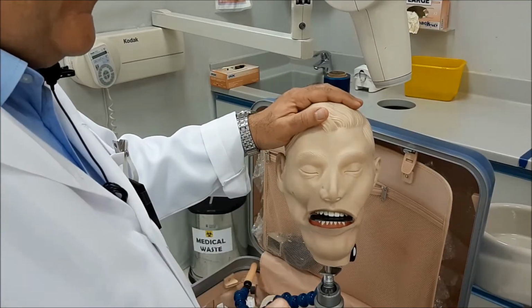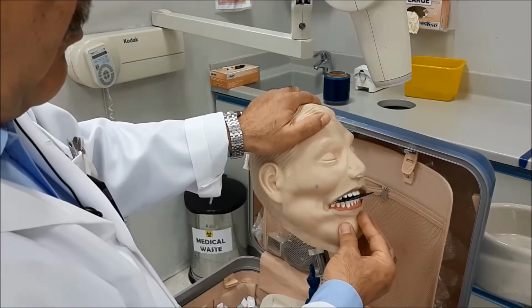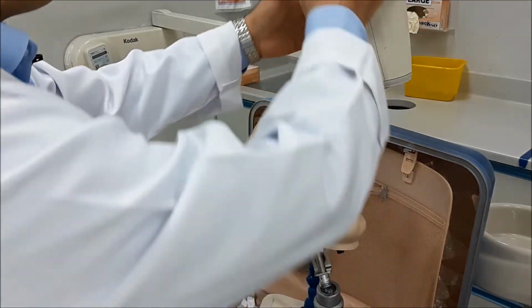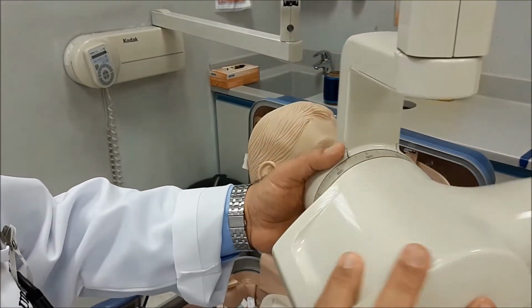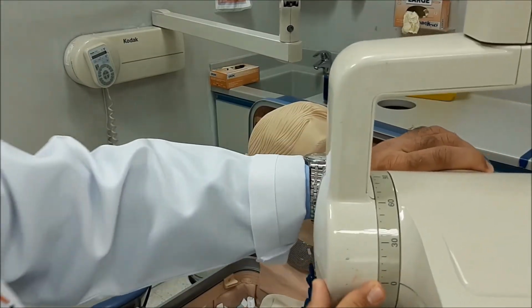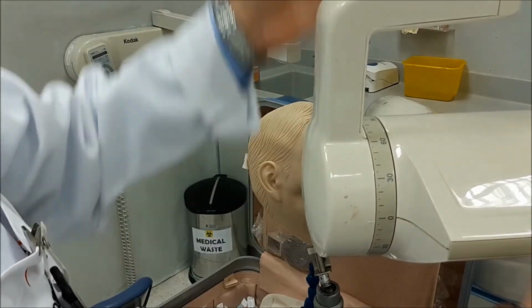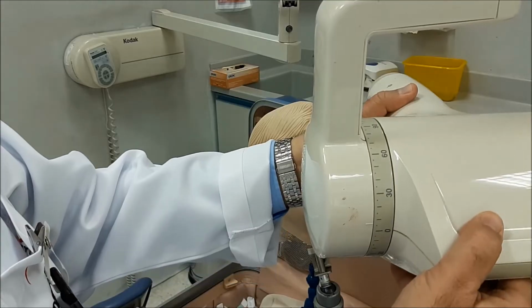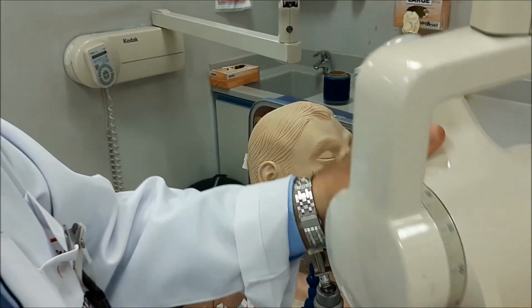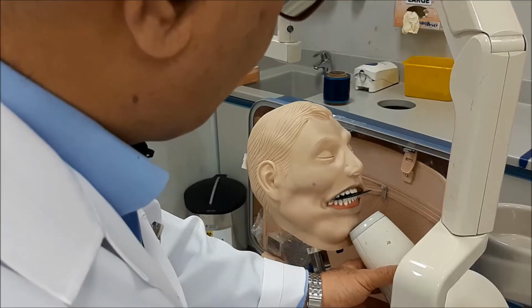Now, as in the maxillary, we have two exposures. Here, if you want the anterior part of the mandible, the symphysis and the parasymphysial areas, then you are going to direct the beam minus 45 degrees up, minus 45. So this is 0 angle, okay? If this is 0 angle, minus, you know, it's upwards. So it's directed upwards, minus 10, minus 20, minus 30, minus 40, minus 45, and then you will direct it on the chin of the patient, okay?